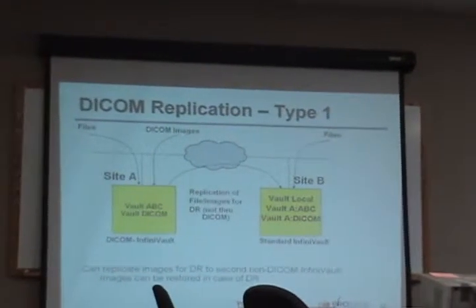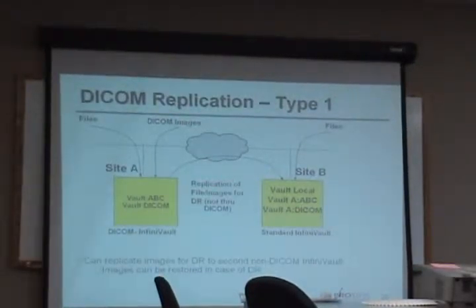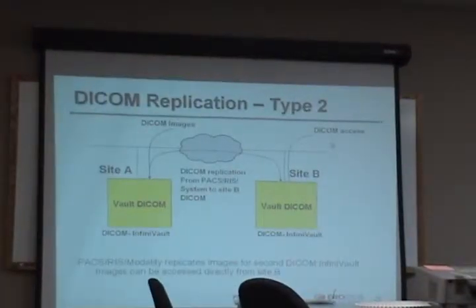Whereas in this case, you've just got DICOM on the source, but not DICOM on the target.